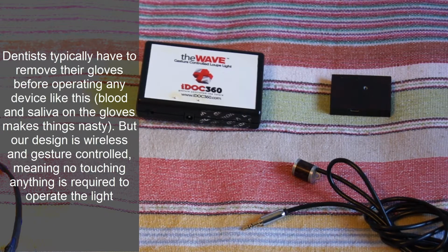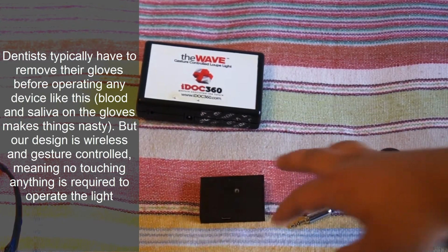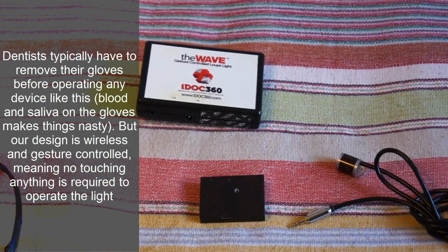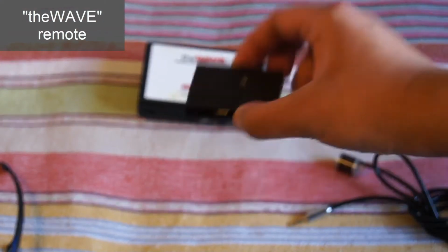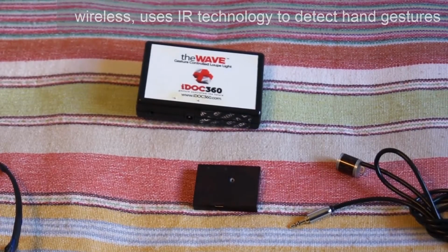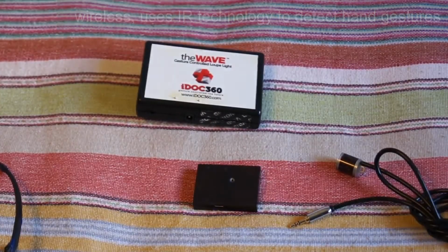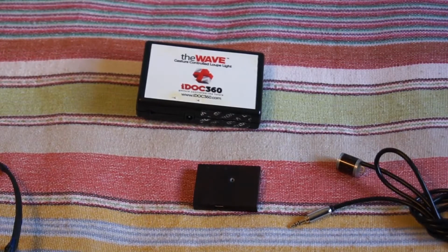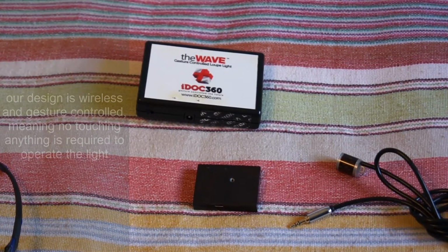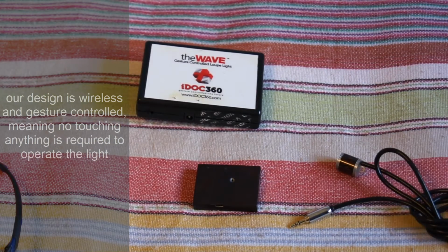So to solve that problem, iDOC360's idea was to make this thing both wirelessly controlled and gesture controlled. This device here is the remote, and it has an infrared sensor that can detect hand motions, hand gestures, so I could do that to turn it on and off. It's wirelessly connected, and that solves the problem because you don't have to touch anything anymore. You just do a wave or some other gesture to control the light.